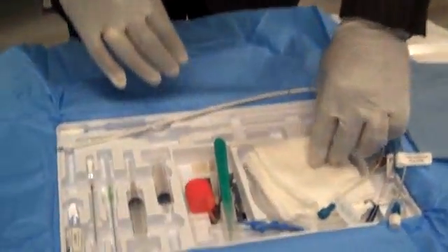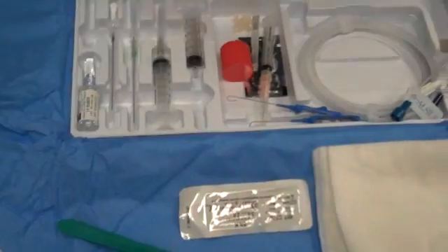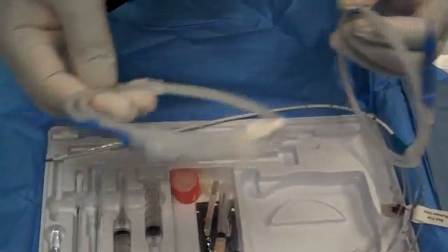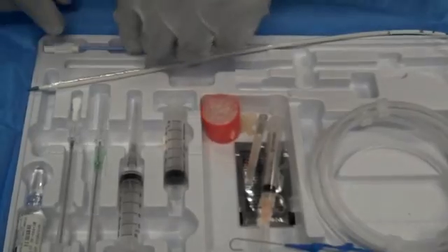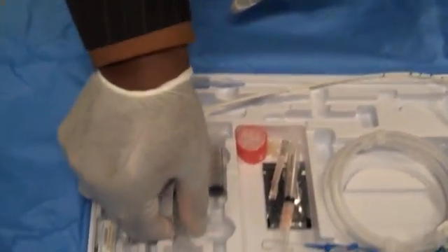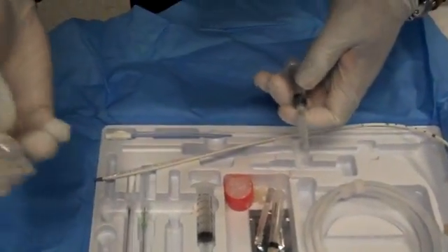In your kit, you have gauze, your suture, your scalpel, and two guide wires. These are basically identical, but if you were to drop one or something happened to one of them, you have an additional guide wire. You also have a 10 French dilator, lidocaine, and your access needles.